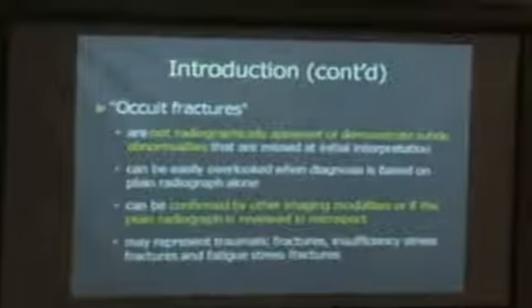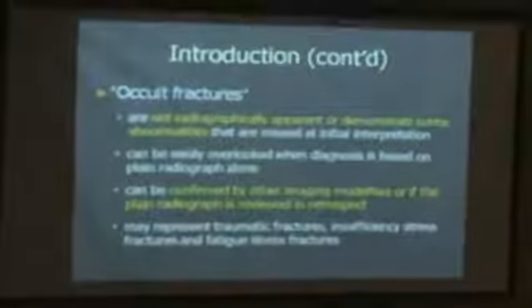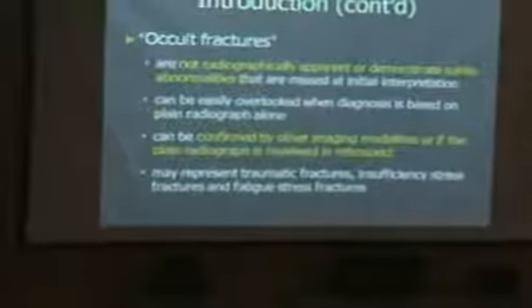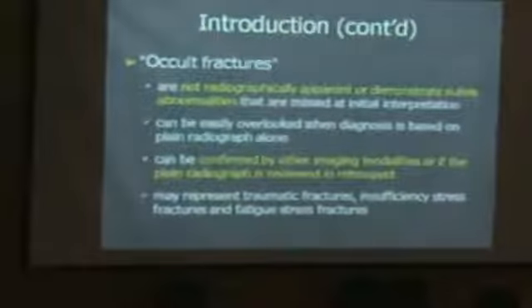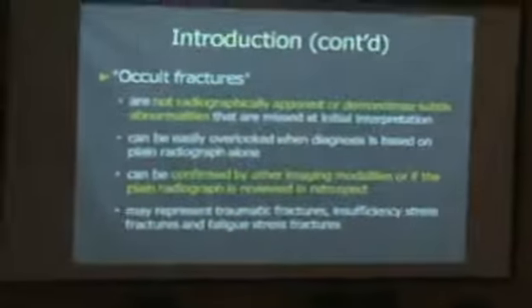Now this is, again, by definition, it can be easily overlooked when diagnosis is based on plain radiograph alone. That's absolutely the case when it happens. And it's confirmed by other imaging modalities, or if the plain radiograph is visualized or seen or interpreted in retrospect.